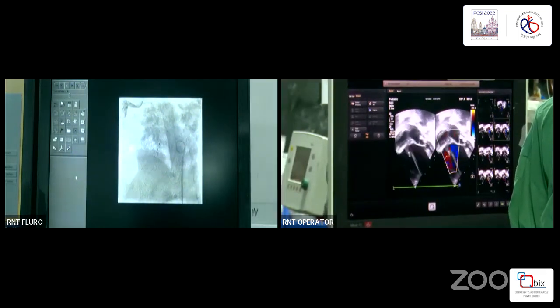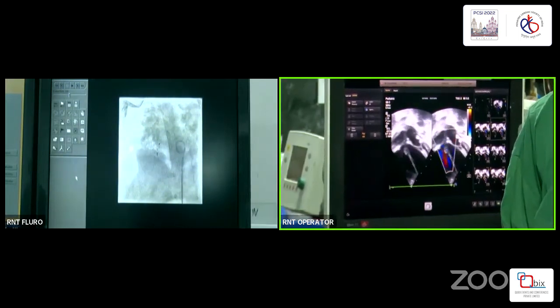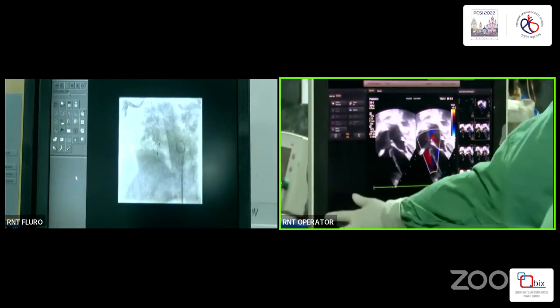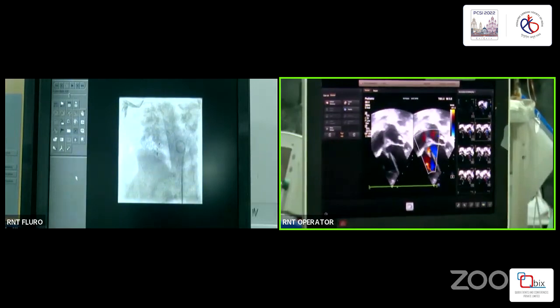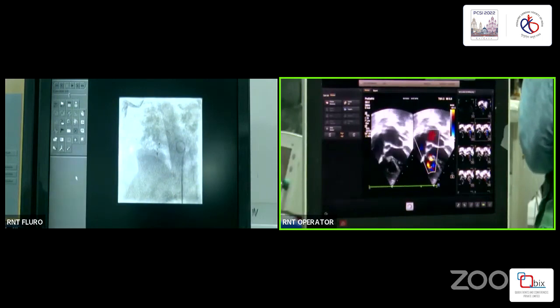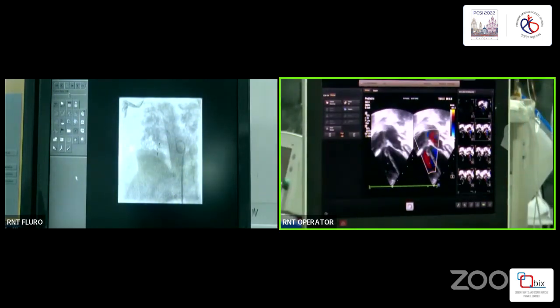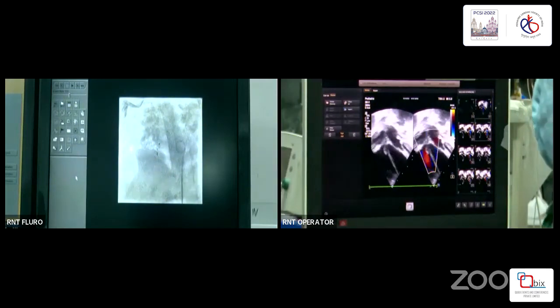Yes, audible. Please. Good evening, sir. This is Dr. Mehul from RNT Hospital. I am with my colleagues, Dr. Devashi and Devabrata. So we have taken one case. This patient was originally planned for surgery due to severe PH, failure to thrive and repeated hospital admissions. But before doing the surgery, we did a pre-surgical echo, and we noticed that there is a little bit of obstruction, that is, aneurysm formation has already started. And PH was coming down.